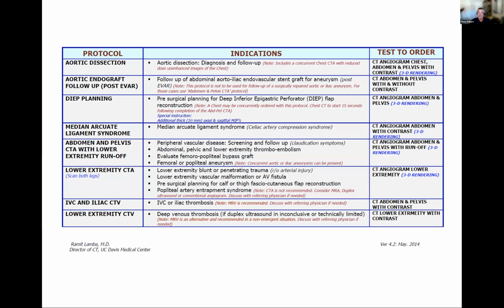But the current guide 2023, I guarantee you, has a lot more specific details demonstrating the fact that technology has changed. Our CT scanners that we have on site now have changed, and there are updates that are continuously occurring with changes in acquisition technology, the equipment that I previously mentioned, and post-processing capabilities. So this completes what I want to show you in terms of the protocoling guide. Now on to the details for the CT scanner acquisition protocols.